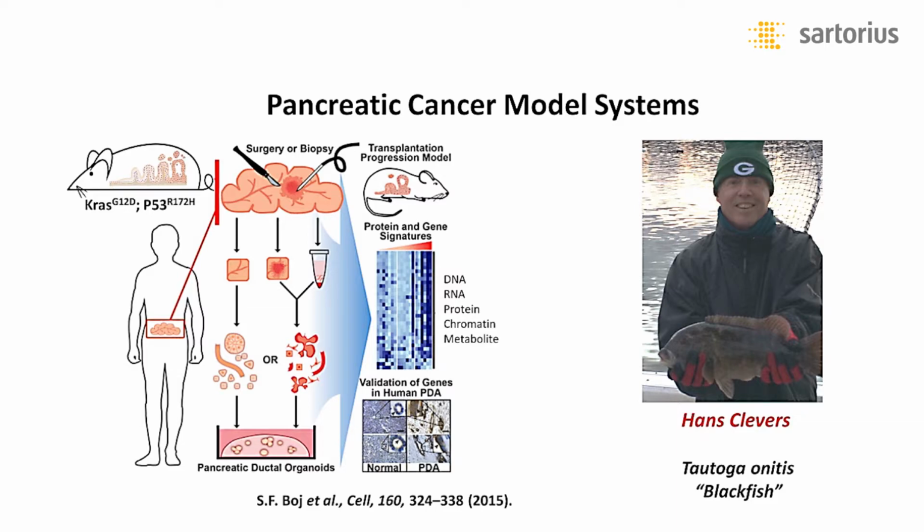The benefit of Matrigel is that you add cold liquids to your cultures and it melts the Matrigel. And so you can actually keep biology stopped or paused while you isolate cells from your cultures and then do your assay of molecular pathways, et cetera. Whereas if you use some of these other matrices, you have to warm it up in order to break the matrix down, which obviously could change many of the parameters you may seek to study.